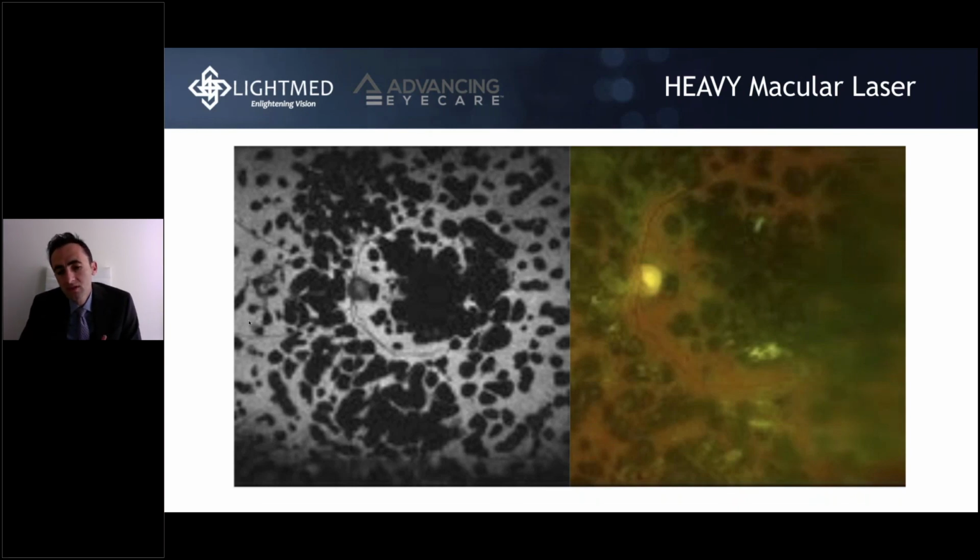So sometimes if the surface of the retina is getting the laser in an oblique fashion, you might get uneven scars, even with the pattern scanning laser. But this can happen with all the machines, and you're treating in the periphery anyway. But usually within the mid periphery or the posterior pole, the laser scars that I've seen are usually even. And also there is always titration up and down on the power of the PRP laser. So as I said, I start with the yellow laser around 240, and with the 561 I start around 220, but then I adjust my power depending on the laser burns that I see.